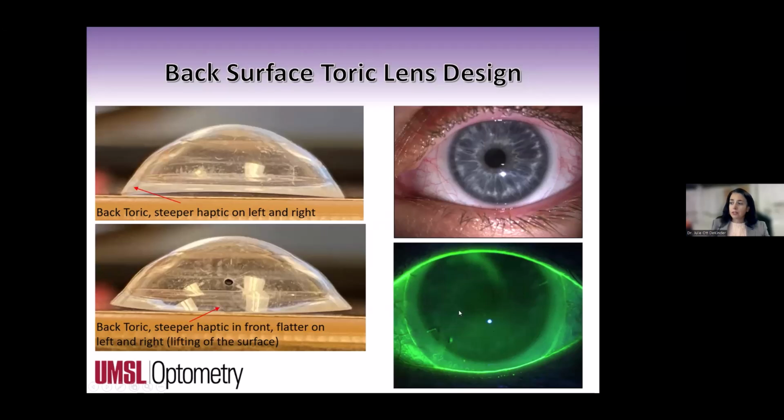So I take my slit lamp and I take my reticule and I line it up right with that. And then I read off the axis and I put that exact axis in my chart, so I know exactly where it is. I say that it's always the flat meridian, and I used to say that without fail. There is definitely one scleral lens on the market now that puts that mark on the steep meridian.